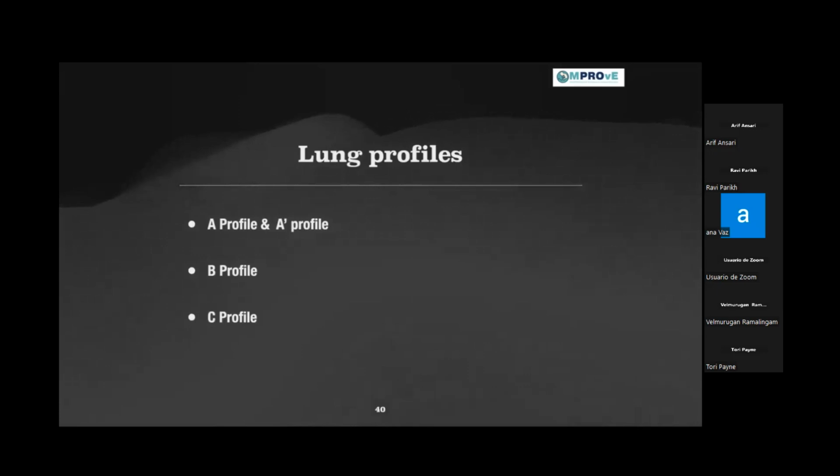So we don't want to do that, because your gain settings will be all wonky. Because it's a bright light falling on the scanner, you will feel like, oh, my scans are appearing quite dark. So you'll put up the gain on the scanner, and by the time you go for the interpretation, or if somebody else is reviewing the image, it will look like an absolutely bright image. You'll not be able to make out much of the scanned area. So the ambient light of the room becomes very important there.